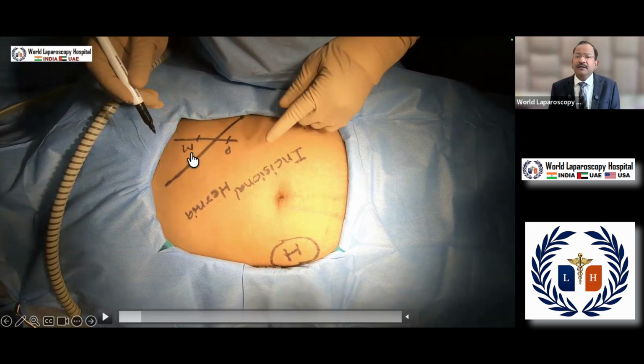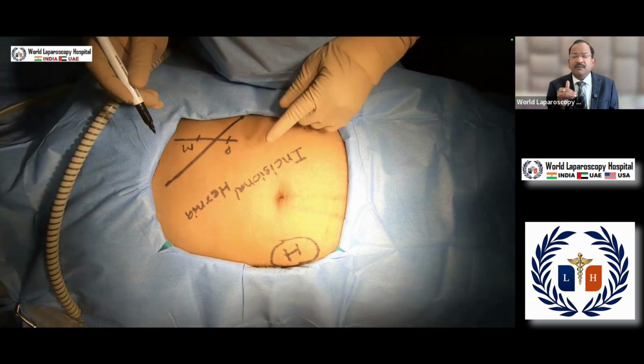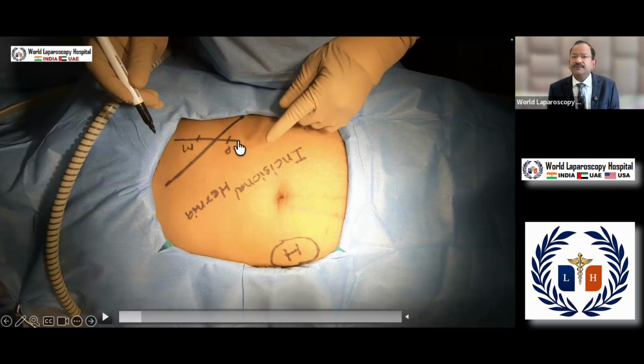What is this point? This point is over the rib. But the question is, are we fracturing the rib, or are we going through the intercostal, or are we perforating the diaphragm? What is this Mishra's point? Actually, it is a stretched Palmer point. So, what will we do? We will stretch it down and bring this area here.